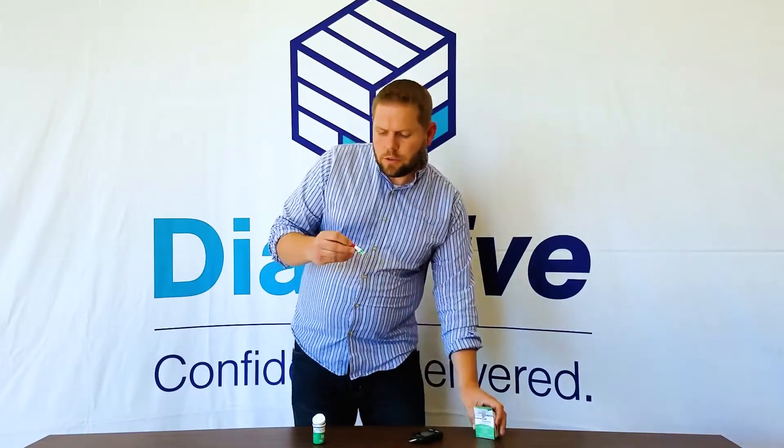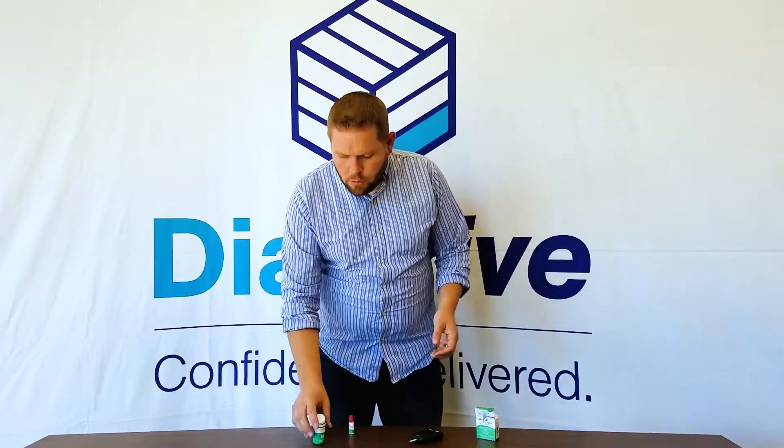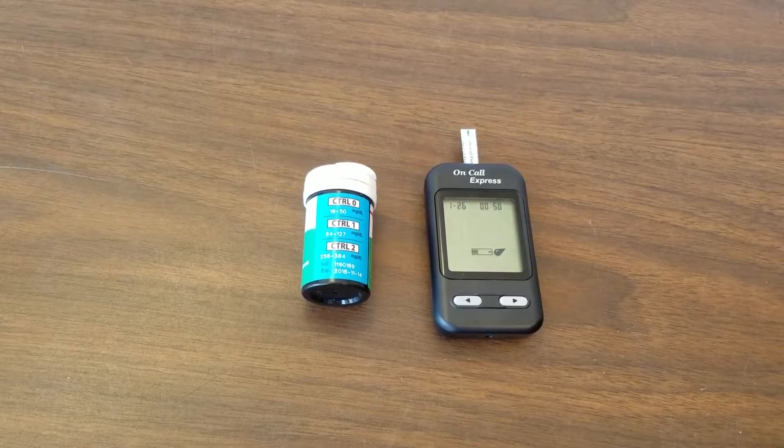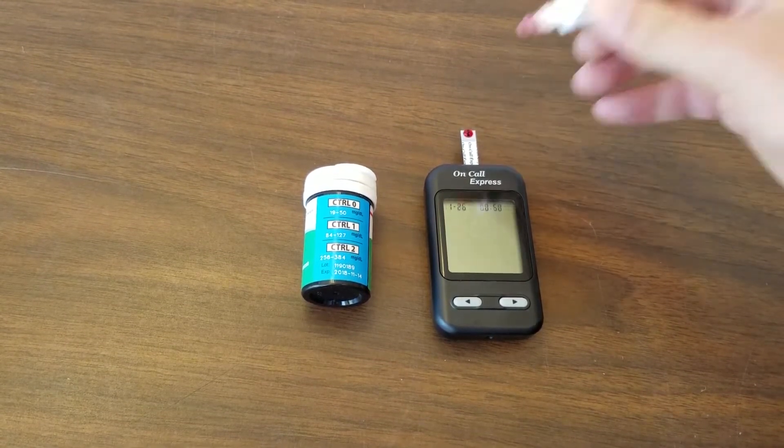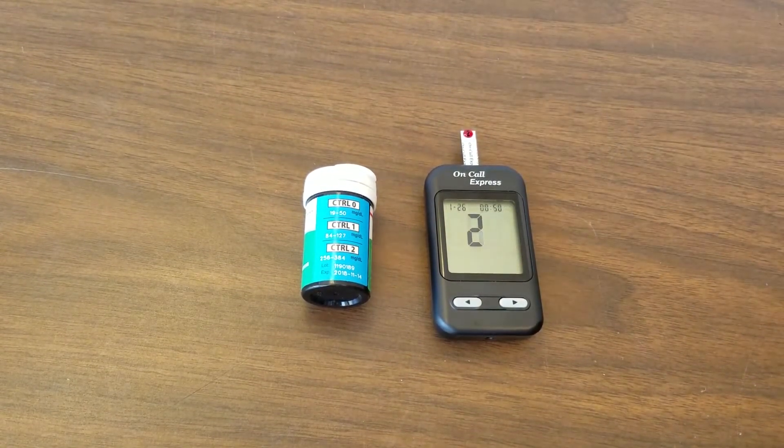Take out a bottle of control solution — right now we'll use number two, which according to my bottle should be in the range of 256 to 384 milligrams. So what you'll do is take your control solution just like you would your blood and put a little bit on the strip, let it read on your meter, and there we go.